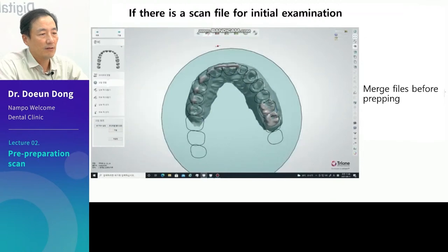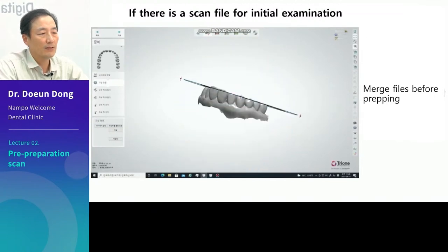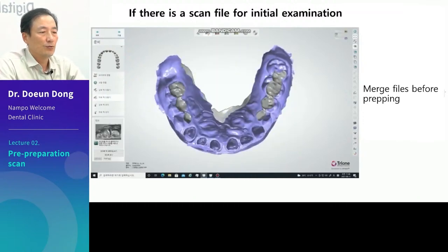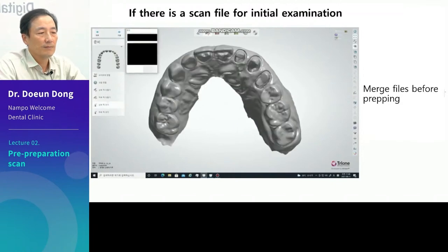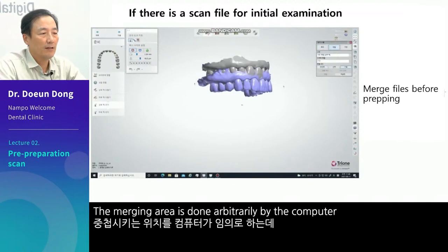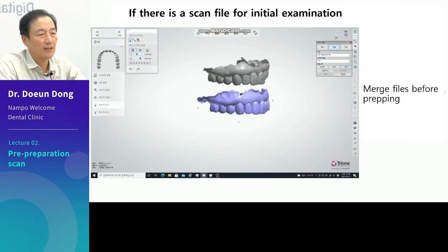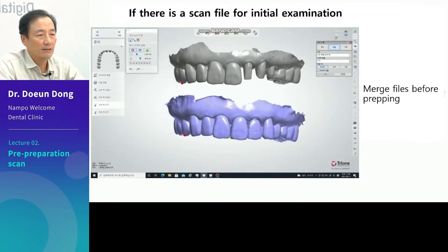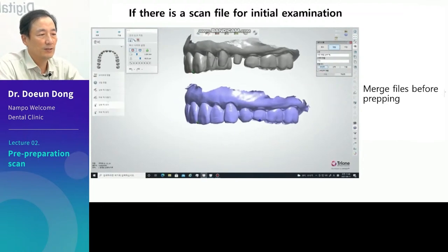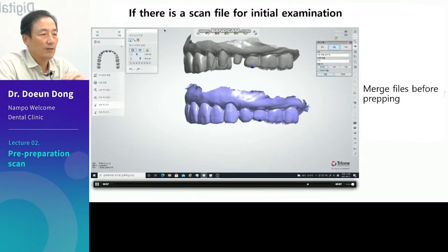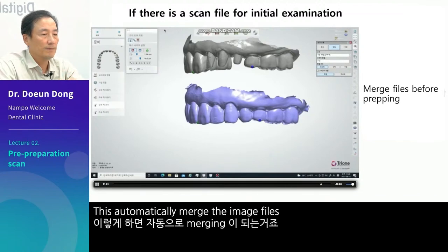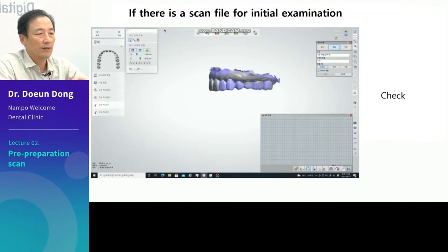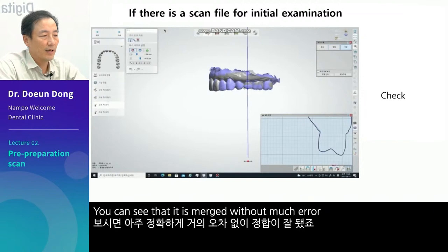The blue is the original data. The gray part is the data after it was pre-prepped. Set up the occlusal plane and merge them together. The merging area is done arbitrarily by the computer and you must match them precisely. Like merging by three points, it is the same as merging in the implant studio — pick the teeth in the same area on the incisal edge or cusps. This automatically merges the image files before and after preparation. Check how accurately it is aligned by drawing a cross-section. You can see that it is merged without much error.